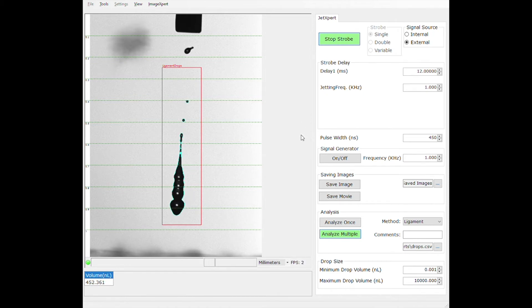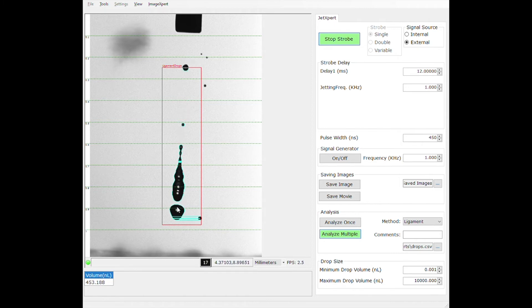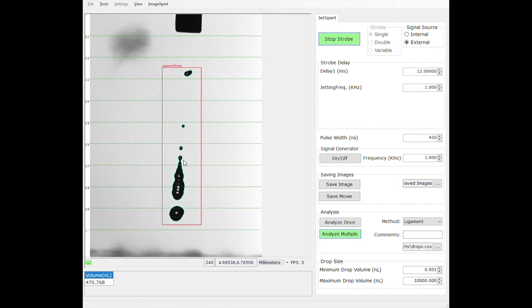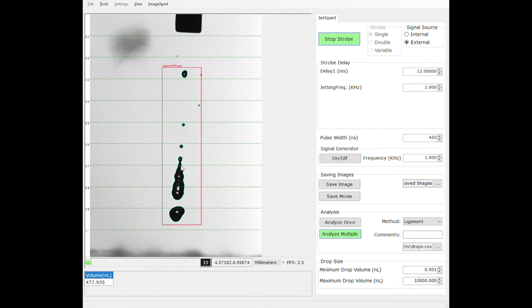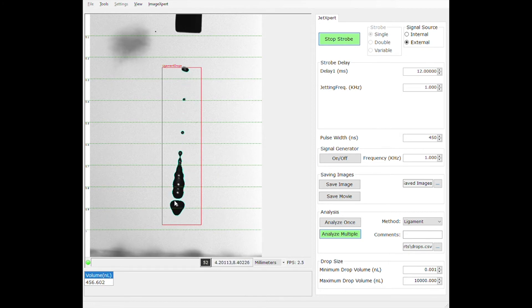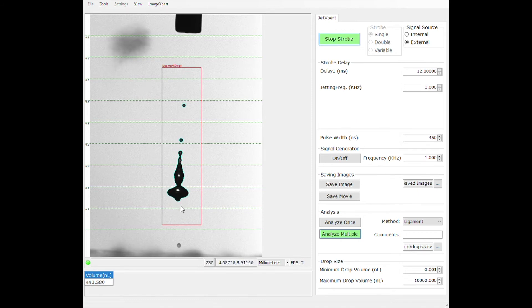Regardless of whether the drop is completely round, a single drop, or spread into multiple, or a drop that is oddly shaped with perhaps a long ligament, the system is able to perform measurements of volume using a variety of different algorithms.